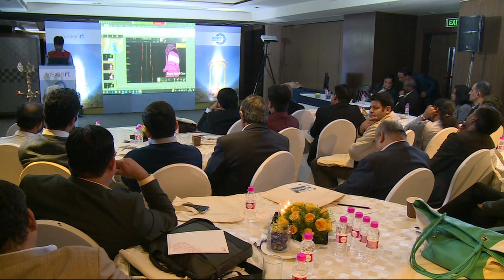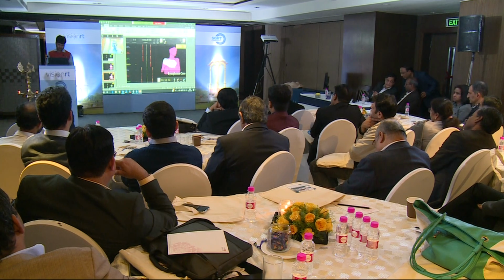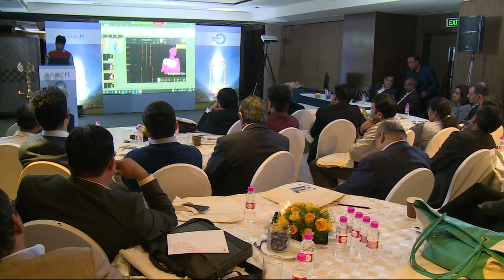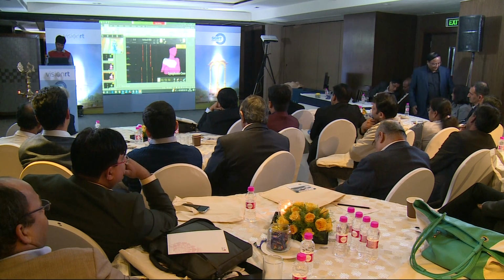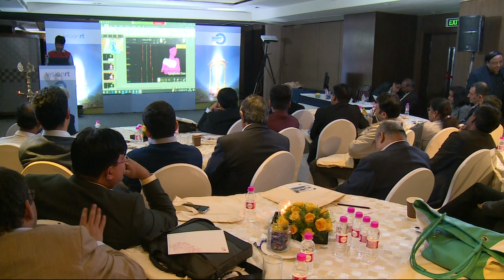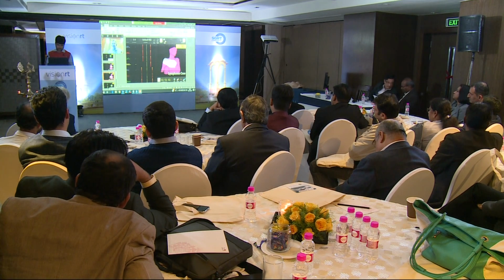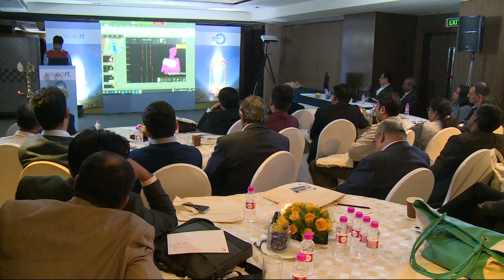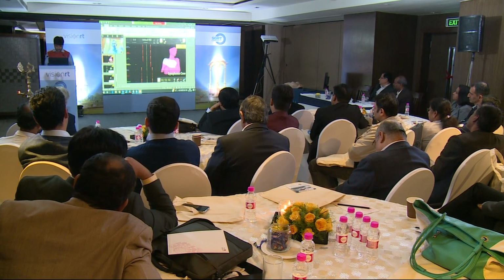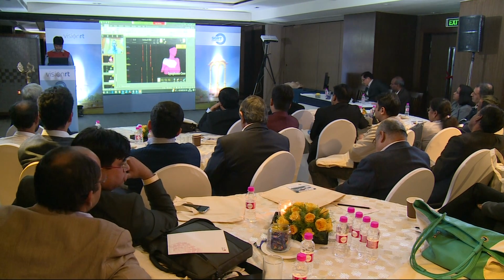Slide 27, this is another extreme posture example. This patient is a lymphoma patient that goes just under her ear, down through her neck, and then down into the axilla. She has a frozen right shoulder, a fused spine, and a number of other issues going on. She was in a lot of pain. In these cases, you can see on slide 27 there, we have a large ROI that kind of covers the chest and the affected shoulder going down into the axilla. That is our starting ROI.